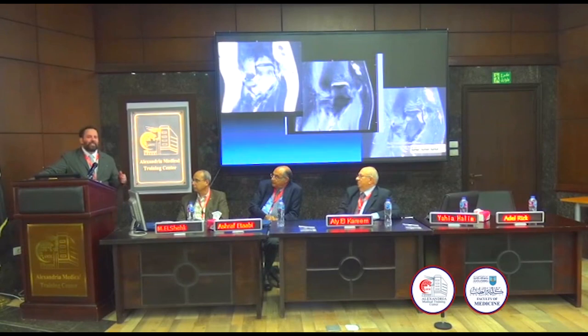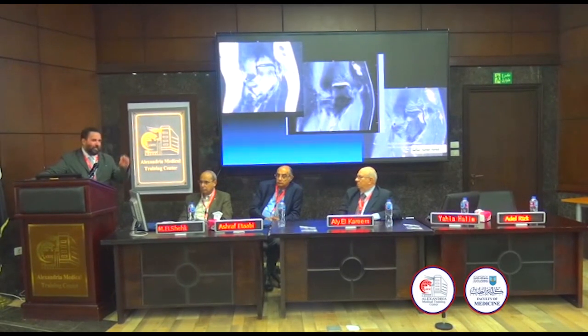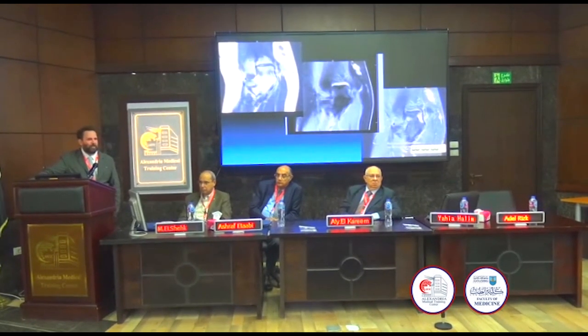I've learned, when I treat fellows now, there's an expression I use. Never trust anyone's old reading, even your own. Because if you read things the same way 10 years ago as you do now, something is wrong. We should all get a little better over time. And I've learned from looking at arthroscopy reports that bodies most of the time aren't loose, and I should have not called it out. Sometimes you're 100% right, and it was pretty obvious on that image, I agree. But sometimes you'll catch them, and they do look like a little ball, like a rounded body.